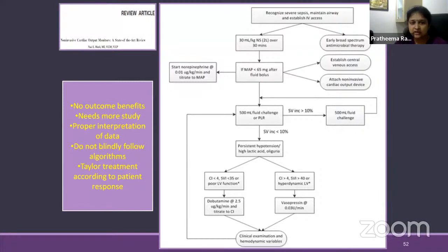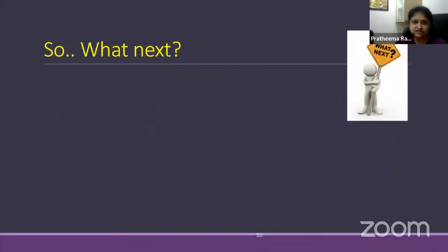They are not totally on autopilot mode, thinking that non-invasive is good. But in OTs, where the patient is going for a high-risk surgery and is not very sick preoperatively, the surgeons are very happy if the anesthetists use the non-invasive methods.